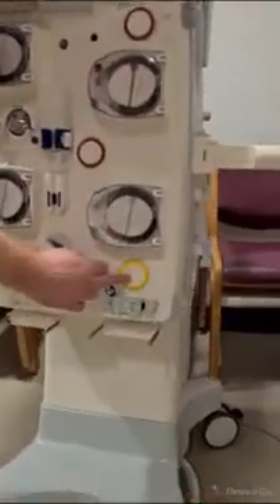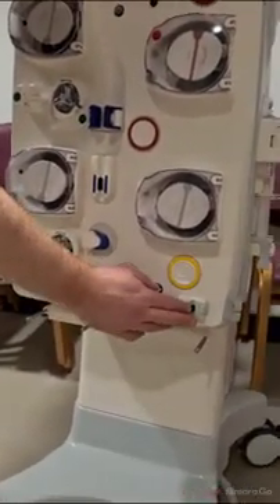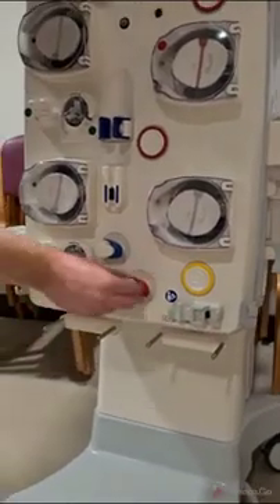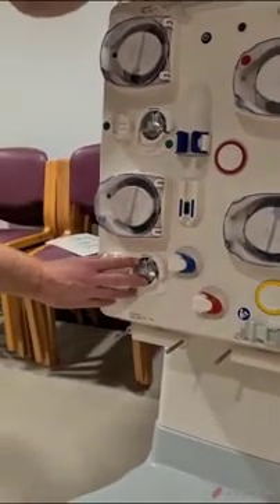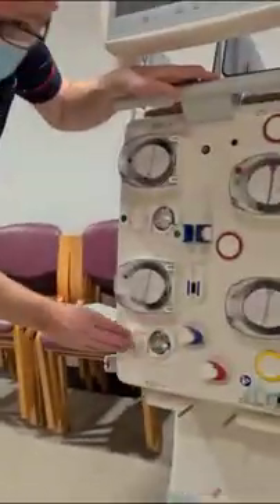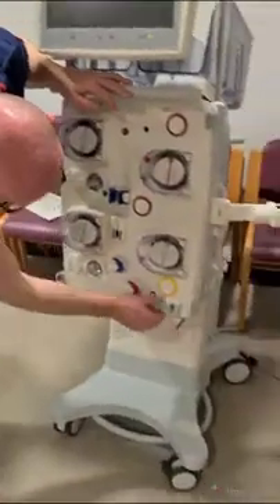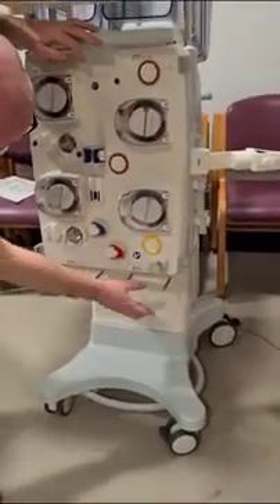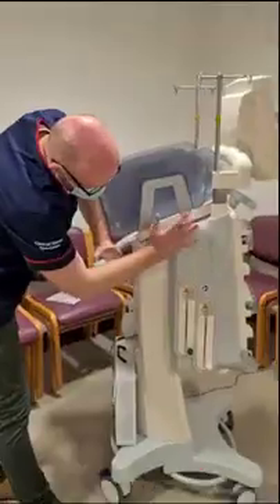Moving further down, we have our filtrate pressure measurement, measuring the pressure at that pump. We have our blood leak detector, our access occlusion clamp, our return occlusion clamp. And this is our calcium pump — citrate at the top and calcium at the bottom. At the bottom we have scales three and four, and this is where we will hang our waste bag, or filtrate bag.